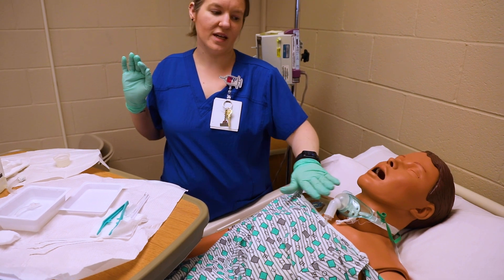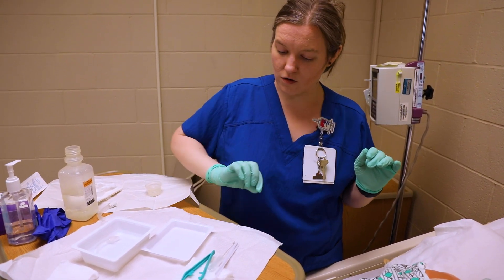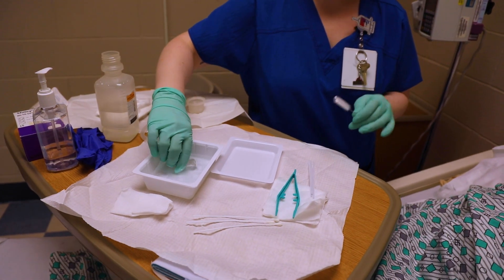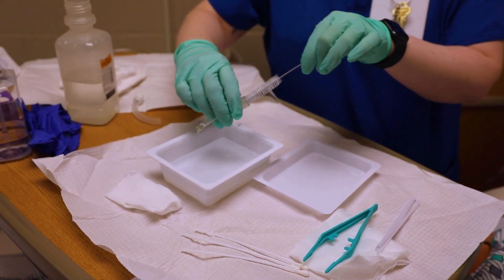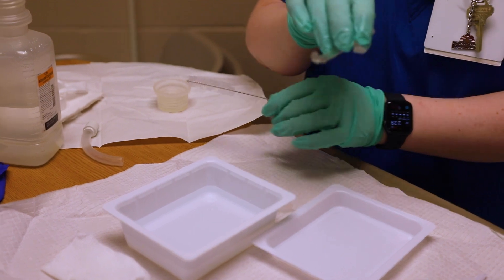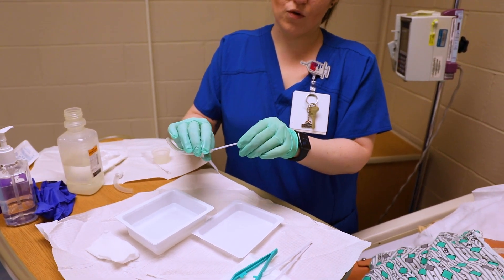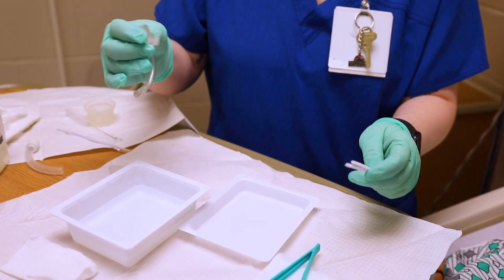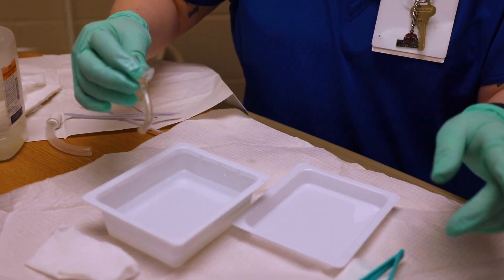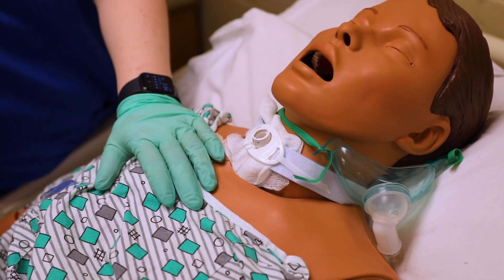I'm going to put the oxygen back on my patient so they're not without it for very long. The clean hand reaches in — actually, the sterile hand reaches in. I'm going to grab this piece and start cleaning: push the brush in there and clean it out. Some trachs are pretty small and you may have to use one of the pipe cleaners. Don't put the brush back in your sterile field. Get it wet, clean the inside and outside, then set it over here to rinse.